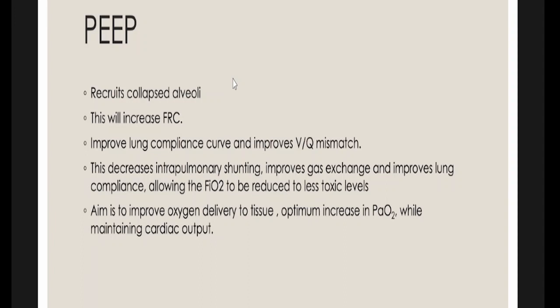Okay, there is a little glitch here. Sometimes when you apply PEEP, that is a positive intrathoracic pressure, it can impair the venous return. So we decide on the PEEP looking at the patient's cardiovascular parameters as well. The usual number that we set is 5, but based on the patient's oxygen requirement and worsening respiratory parameters, we will go up on the PEEP, sometimes to 8 or even 10.